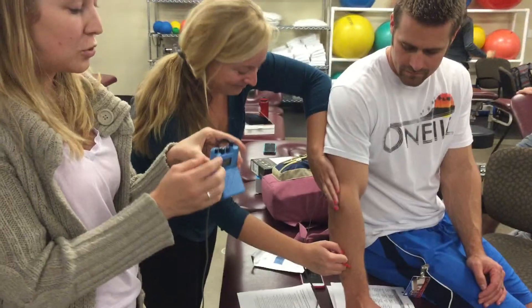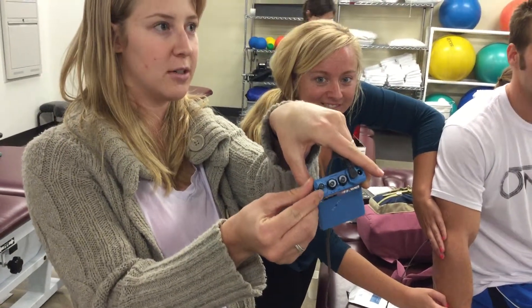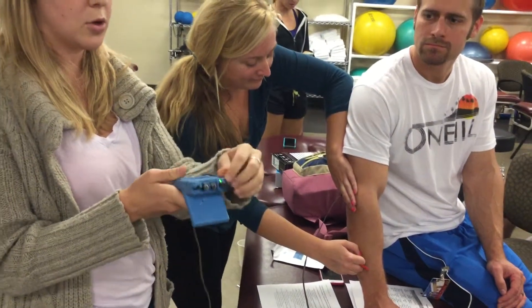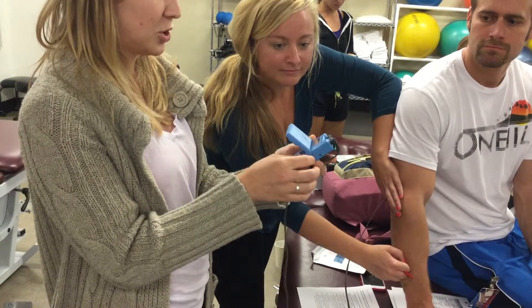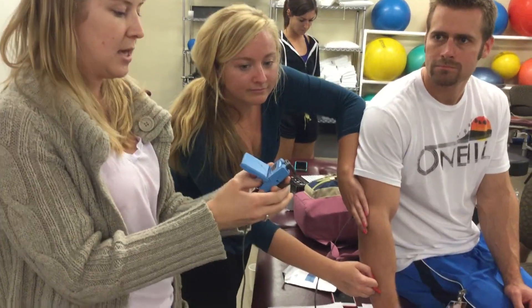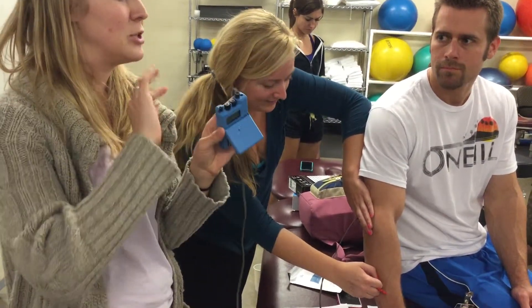Once they're properly hooked up, use the top button and change it to R, which means run. You'll see a green light on top turn on. It takes 30 seconds to ramp up, so the patient may not feel anything for the first 30 seconds.